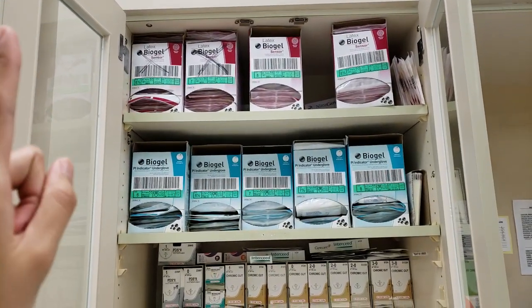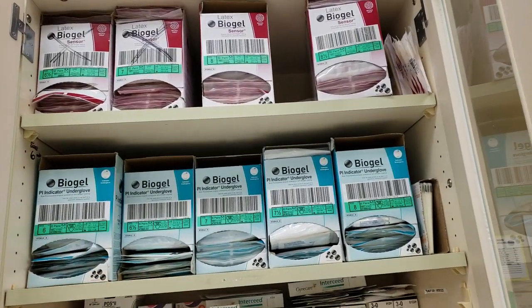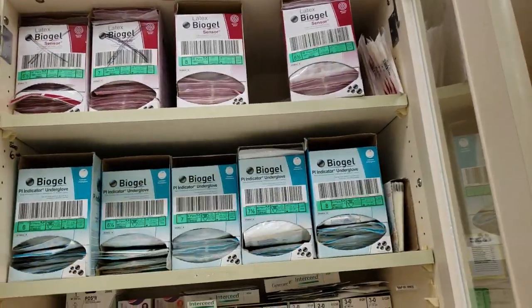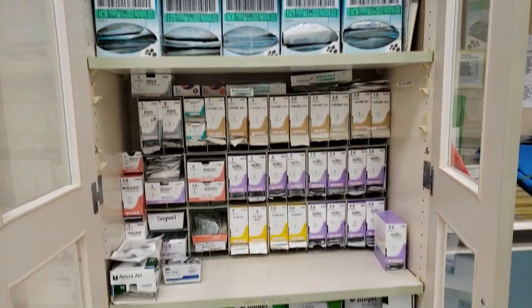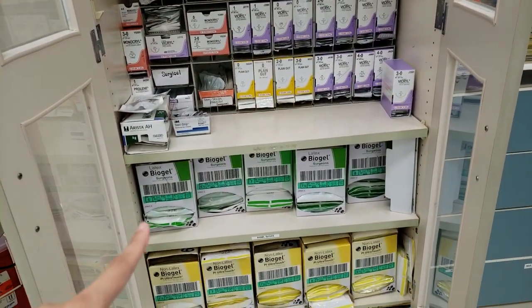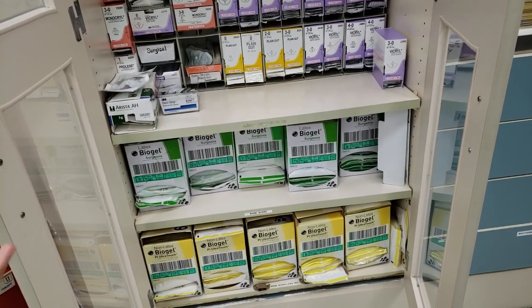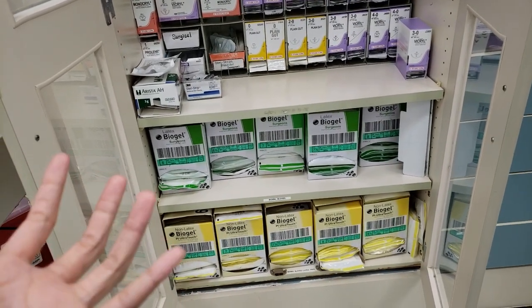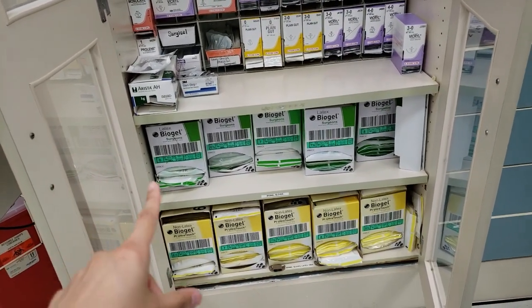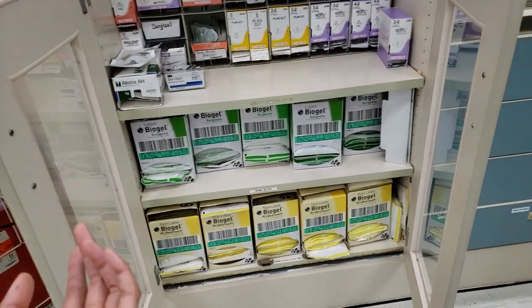Sensors, no worry, nobody really uses these sensors. That's why they're all really packed up. Only one size because only one doctor uses that. And then the Surgicals is what I currently use at this hospital, but in other hospitals I use Eclipse, which they don't have here. It's more flexible and more comfortable on my fingers, and these Surgicals are a bit tight for me. So that's what we have.